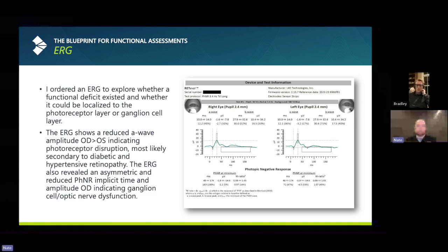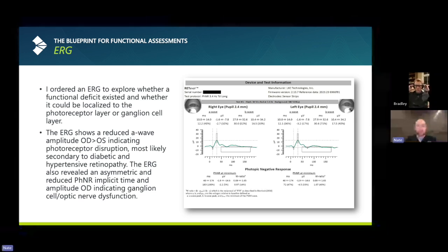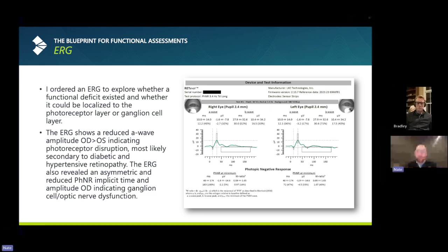I think the interpretation of the report is the quickest. I mean, you think of setting up the test, performing the test, and interpreting the test. Once you start doing this, interpreting the test is the quickest of the three, and they're all quick. Setting up the test takes, I don't know, a minute. Performing the test is going to take you between 45 seconds and a minute and a half per eye. And then interpreting it is a matter of 30 seconds, if not quicker, once you look at this and go, yep, boom, boom, boom, here we go.